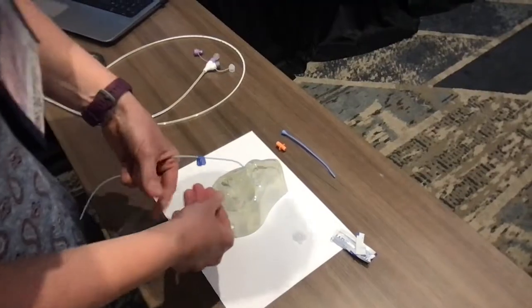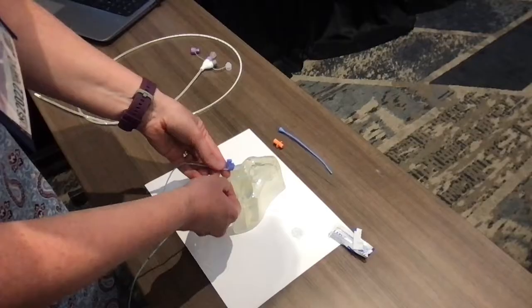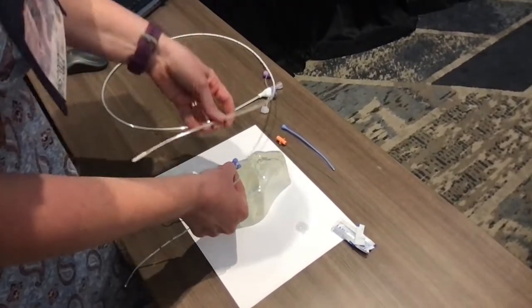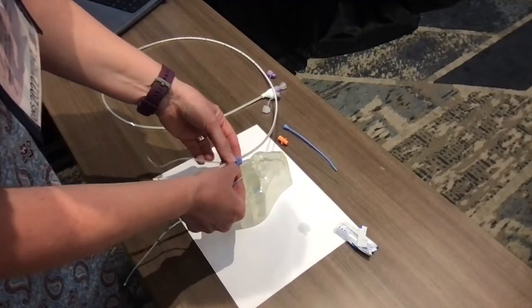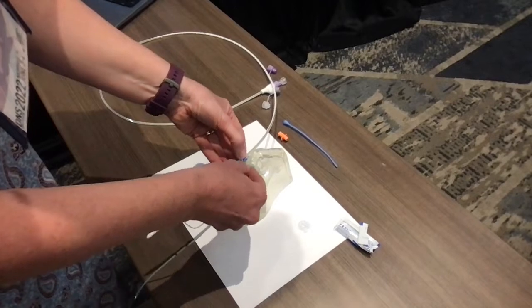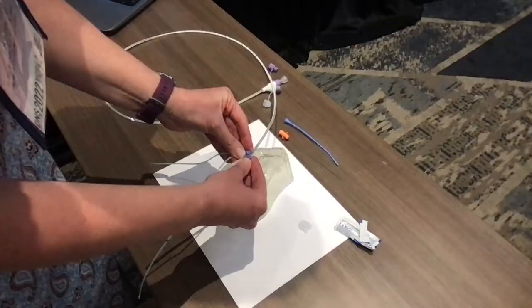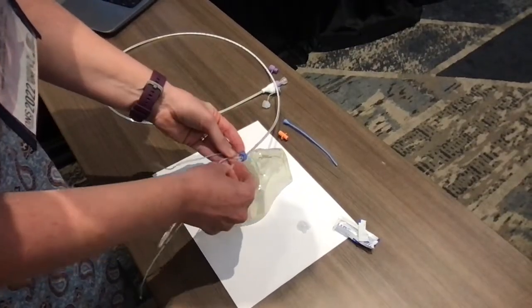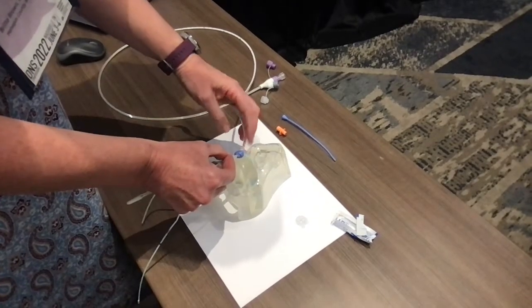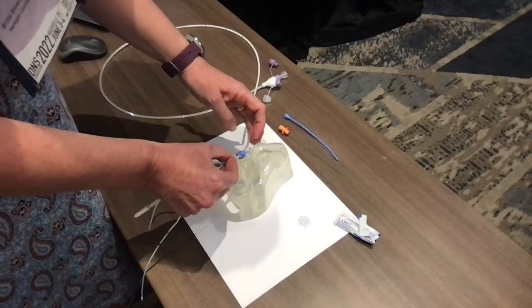At this point you end up with two filaments hanging outside of the nairs, and then you're ready to secure the feeding tube. If the feeding tube were in place, you would take the tip of the feeding tube, put it in the clip where there's a groove, and then the second filament would go across the top so you could secure the feeding tube by closing the blue clip. It's best to leave about a centimeter — or a finger's width — of space between the clip and the nairs so that you don't have skin breakdown.